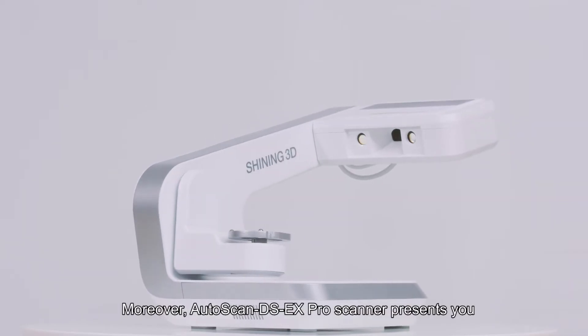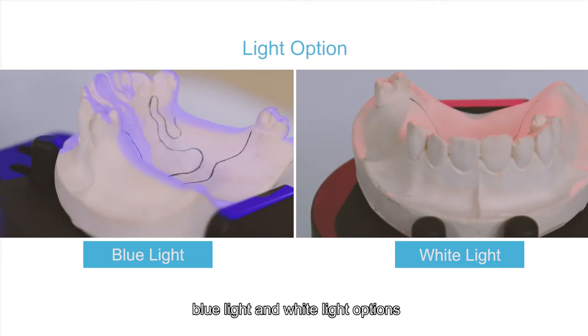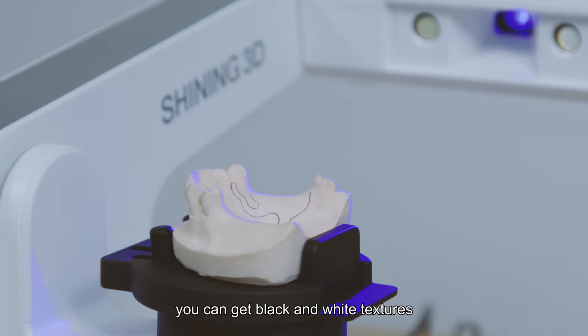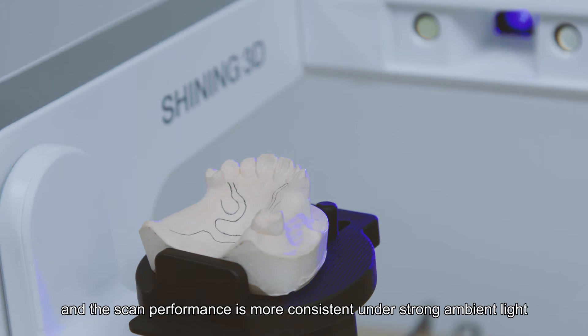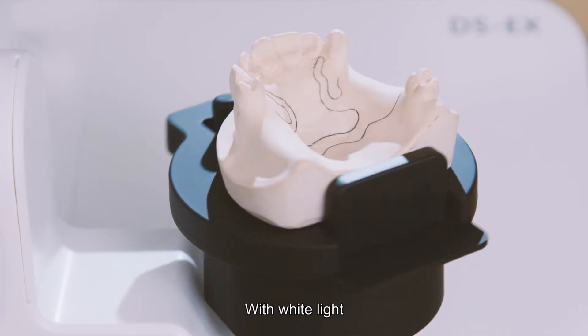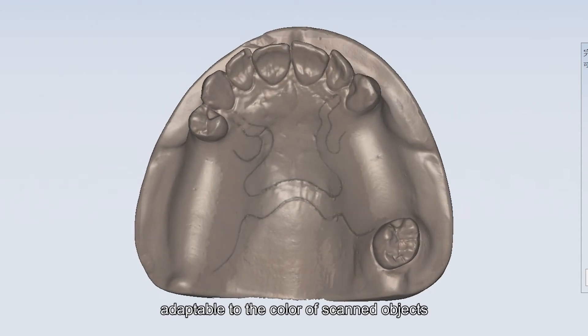Moreover, Autoscan DS-EX Pro scanner presents you blue light and white light options. With blue light, you can get black and white texture and the scan performance is more consistent under strong ambient light. With white light, you can get color texture and the scan is more adaptable to the color of scanned objects.